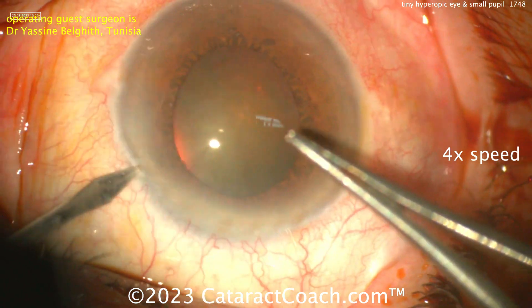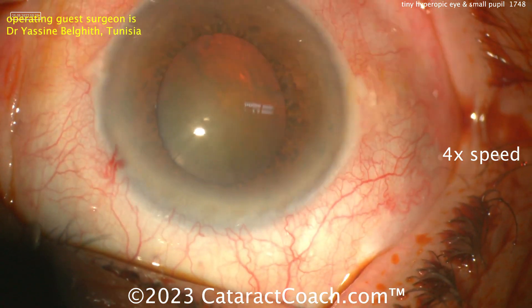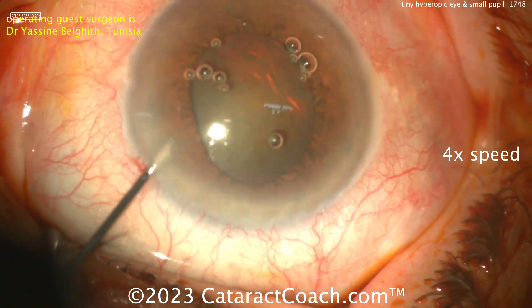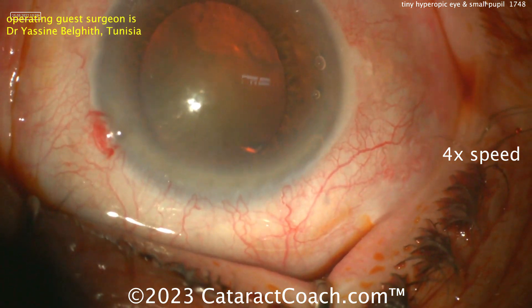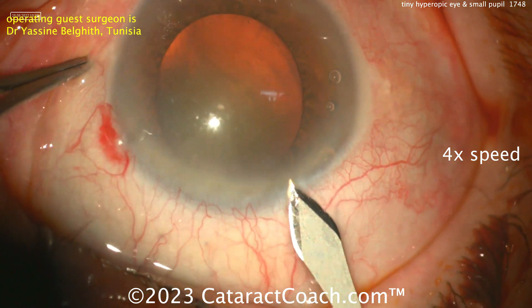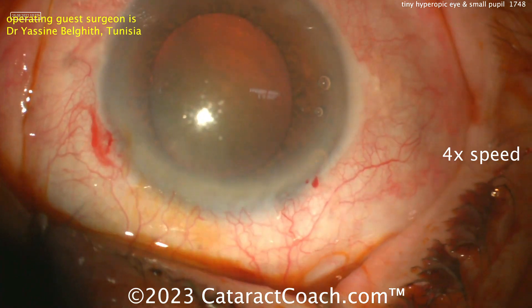So probably amblyopic here in this eye, but the tough part is it's a tiny eye. There's the paracentesis being made — looks like the surgeon is sitting superiorly. The video is sped up. Making the main incision here, looks pretty good — looks like 2.2 millimeter microcoaxial.